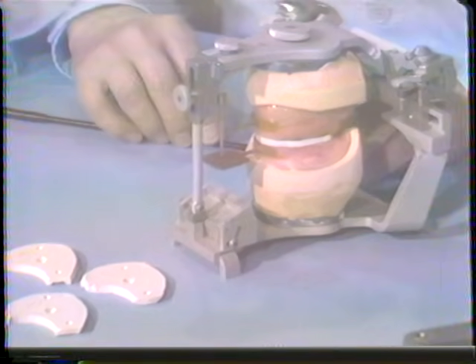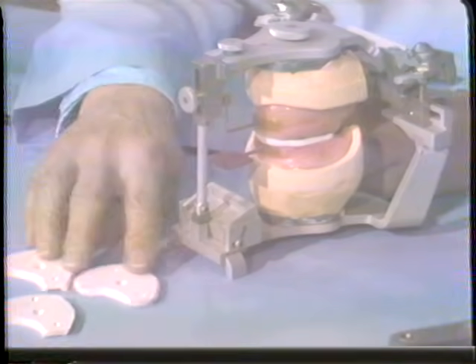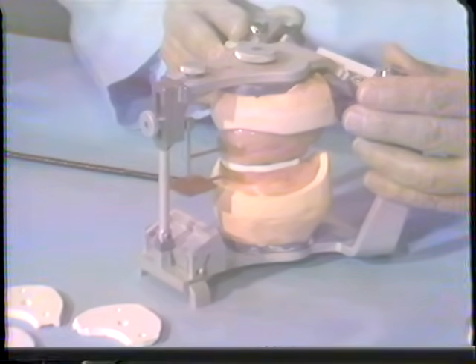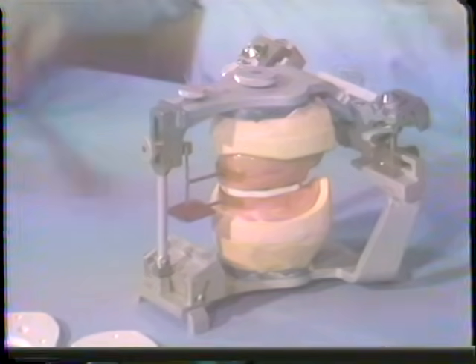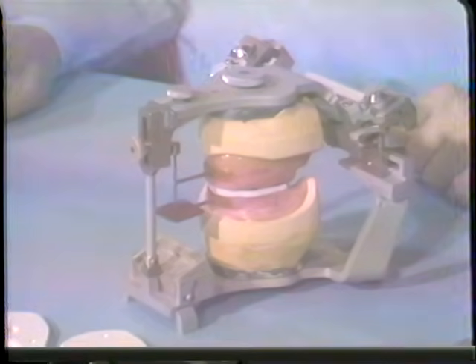However, again, it's a matter of getting more information from the patient with these lateral records, the right and left lateral records, and if we can set the instrument guides to these positions, then again we have more information recorded from the patient and transferred into the instrument. And we hope that we come out with a little better balanced occlusion in the end result.